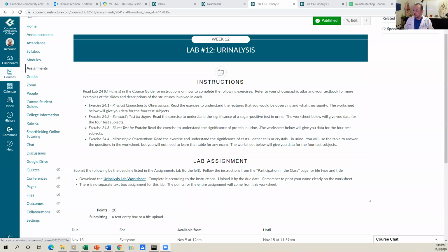This video will quickly demonstrate how you are going to perform the urinalysis lab involved in lab number 12 of this semester. When you go to the Canvas website, you're going to go into module number 12, and under the lab, it will give you the different exercises to perform.